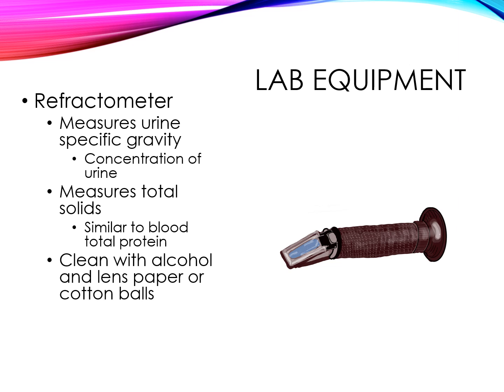A refractometer measures the concentration of different solutions by measuring the angle of refraction, or the degree to which light changes direction when it enters the liquid. They are used in all different industries, and in vet med, we use it specifically for 2 functions really. We use it to measure total solids of plasma when we do a PCV, or hematocrit tube. You break them in half and you use the plasma that's in there to read total solids. And then we also use it when we're doing a urinalysis.